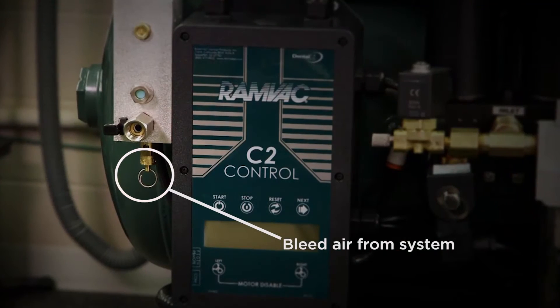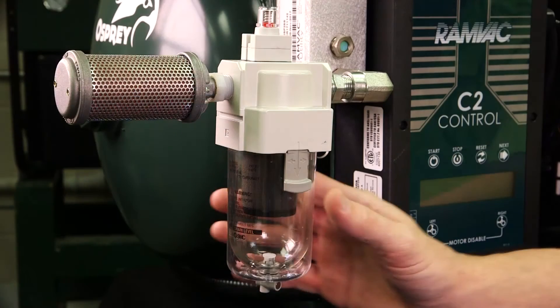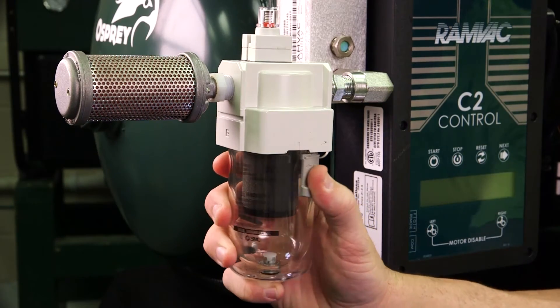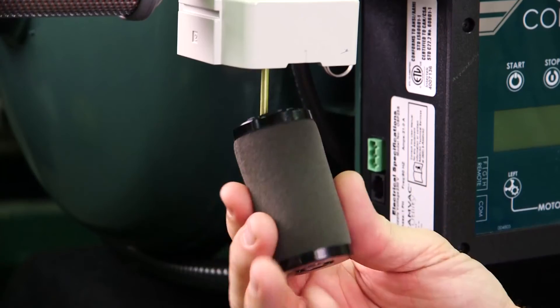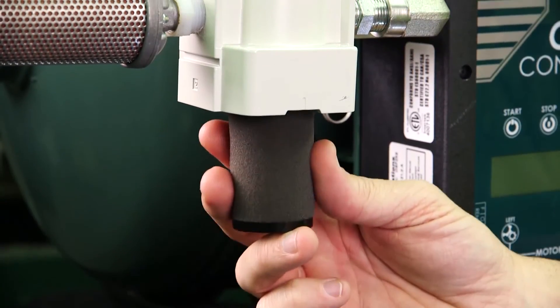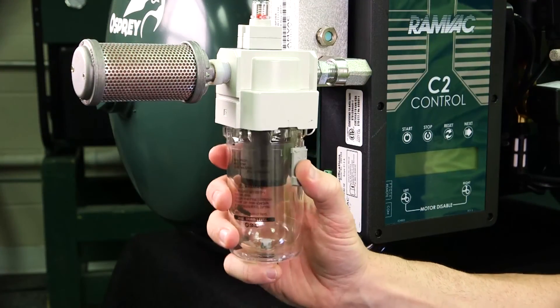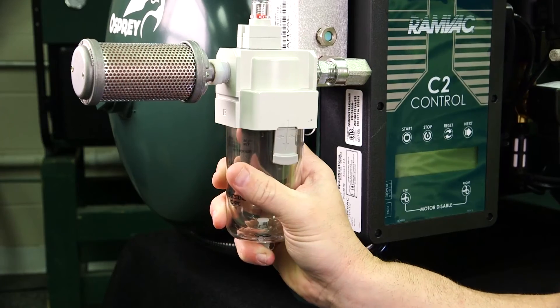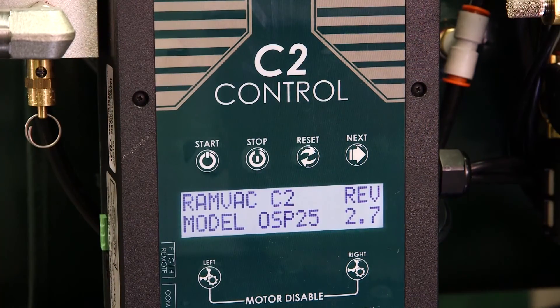Third, bleed air from the entire system. Fourth, push up slightly and turn the particulate filter bowl slightly and remove. The fifth step is to remove the filter by turning completely out. Sixth, install a new particulate filter. Then position the filter bowl, push up slightly, and turn into place. The next step is to plug in the compressor to return power.